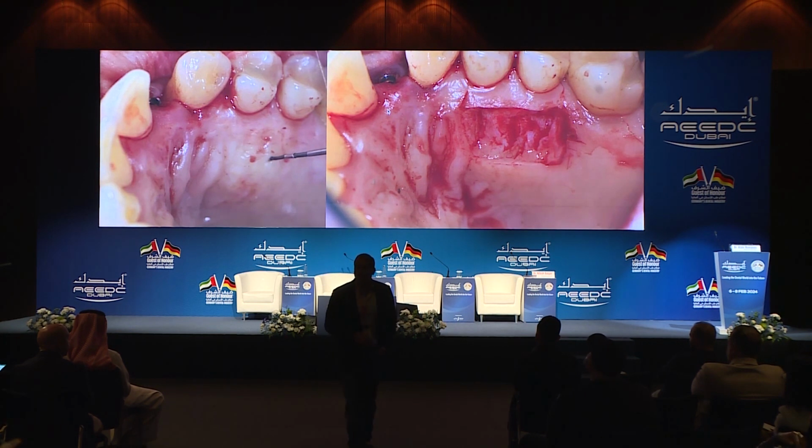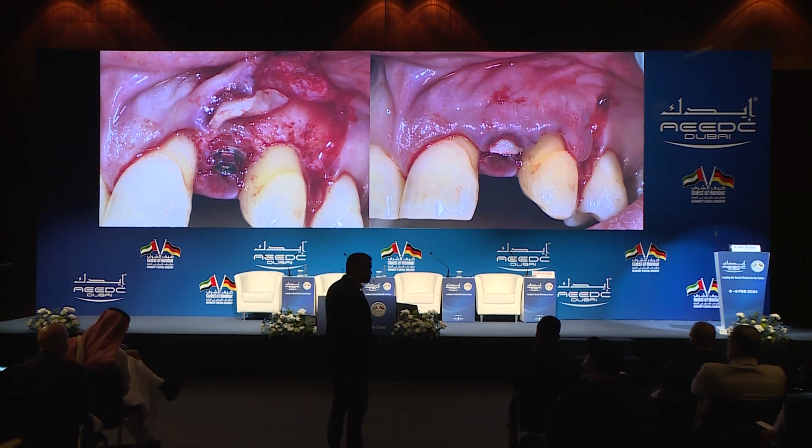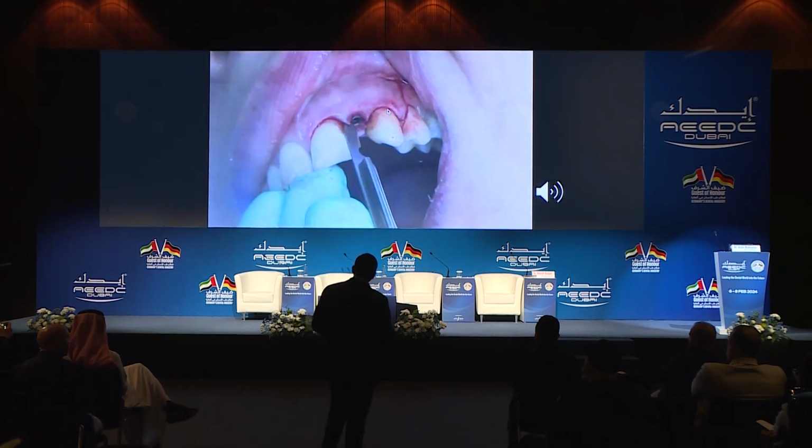So we removed the crown, took the anterior palate, harvested, converted into connective tissue graft, put the implant back to sleep, so place with cover screw, and always use a sterilized cover screw. Don't use an old one or a non-sterile one. Because it happened to me once and it got an infection, so always use a sterile one. And then this is what we did.